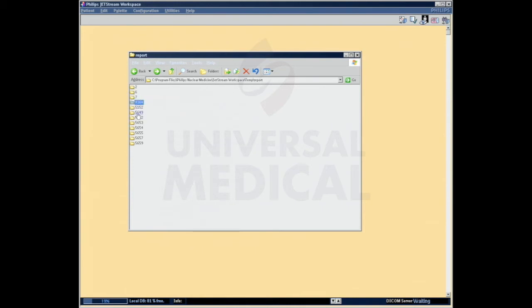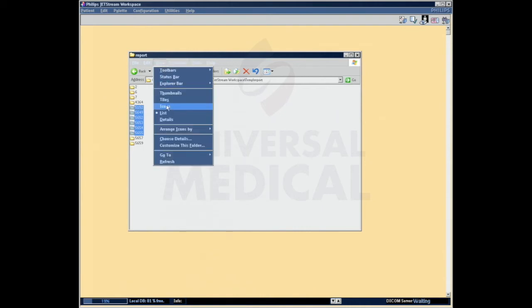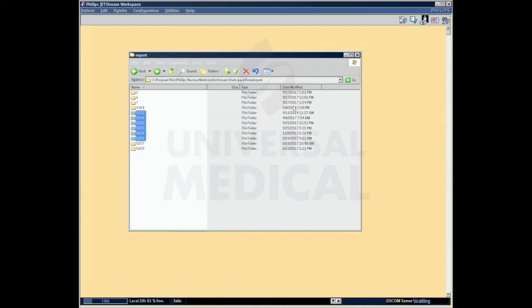All you do, I don't want these particular scans anymore, and you could view this by details, which will actually tell you creation date. I can sort by creation date, and I can say I don't want these particular scans. I don't want anything before, in this case, 2014, or anything after 2014 or before 2014. I can select years of scans. I can select month ranges of scans. However you want to manipulate this.